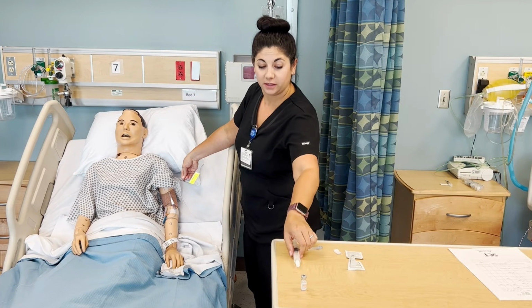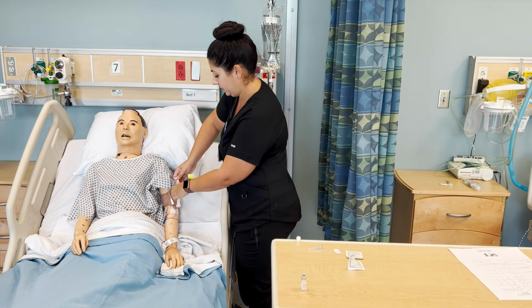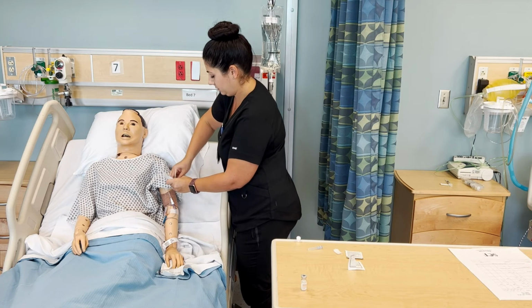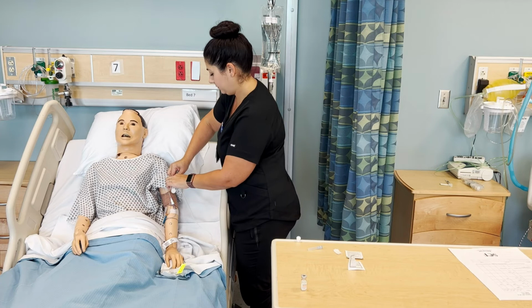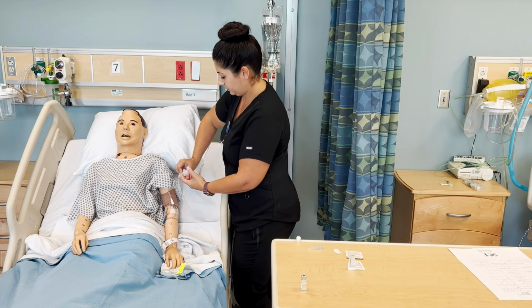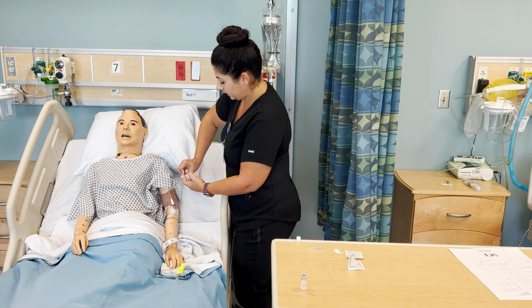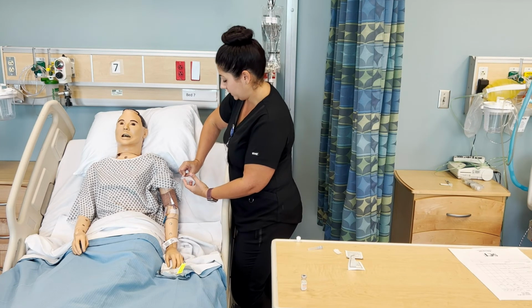Once it is all in, you will flush with another 10 milliliters of normal saline. Keeping that tubing clamped the whole time. The first milliliter of this flush should be at the same rate as your medication was given.